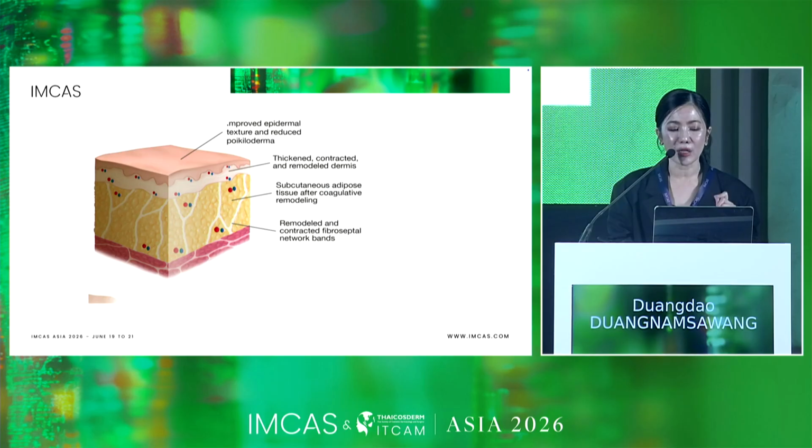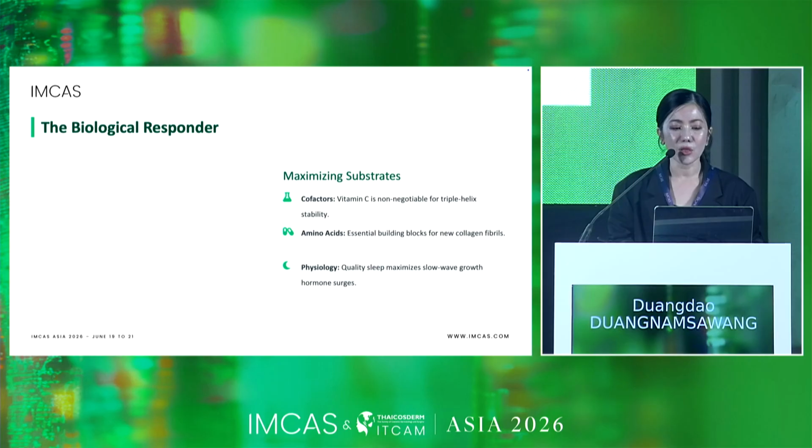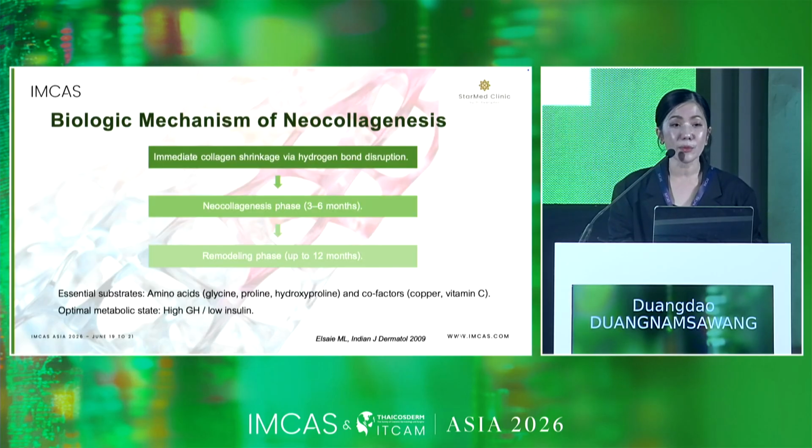Another tissue that I have told you before about is the fibroseptal network. We want to contract and remodel them. And the last one is the subcutaneous fat. So why is the biological response very important? Because of the mechanism of neocollagenesis: after we put the heat inside the tissue, there is neocollagenesis after that, 3 or 6 months later.